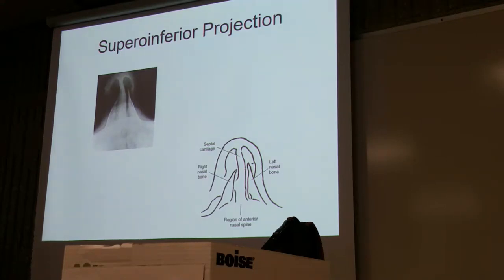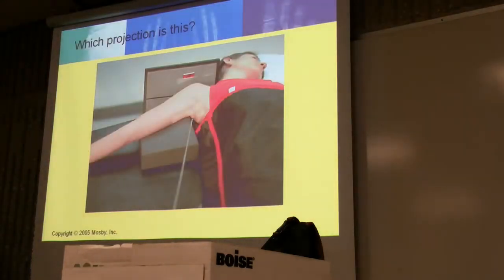If we were entering the bottom and exiting the top, what is that now called? Infero-superior projection. Okay, good. Any questions here?